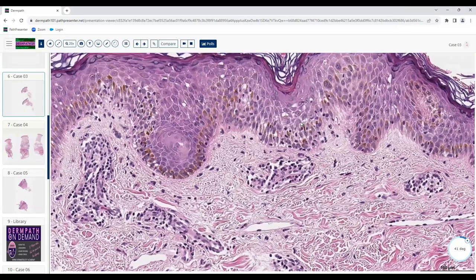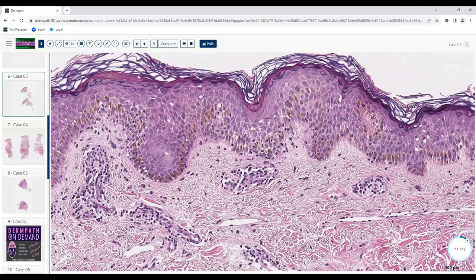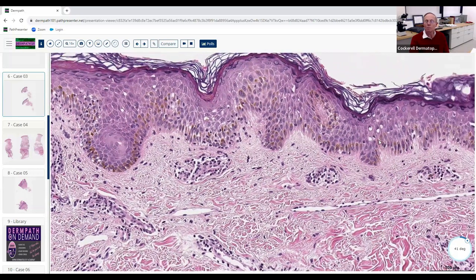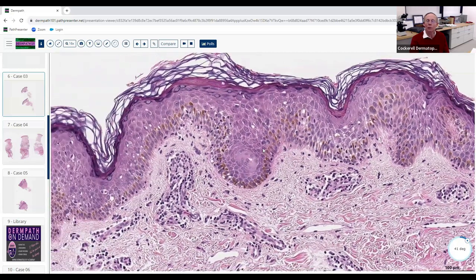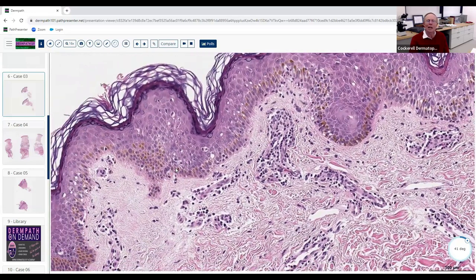What's in the differential for this pattern? When you see interface change, a big category is connective tissue diseases — dermatomyositis and lupus erythematosus. Dermatomyositis tends to have more atrophic epidermis, and lupus as well. Those are probably the two main ones to include. But the epidermis looks normal here — no mucin in the dermis, no marked thickening of the basement membrane zone — so lupus and dermatomyositis are maybe a little less likely, but certainly in the differential.